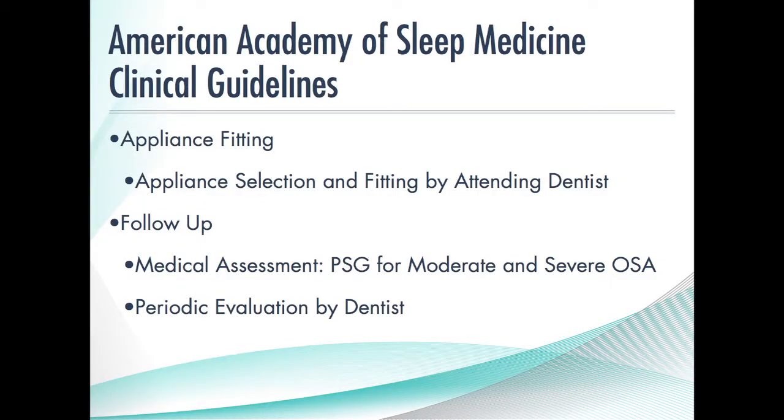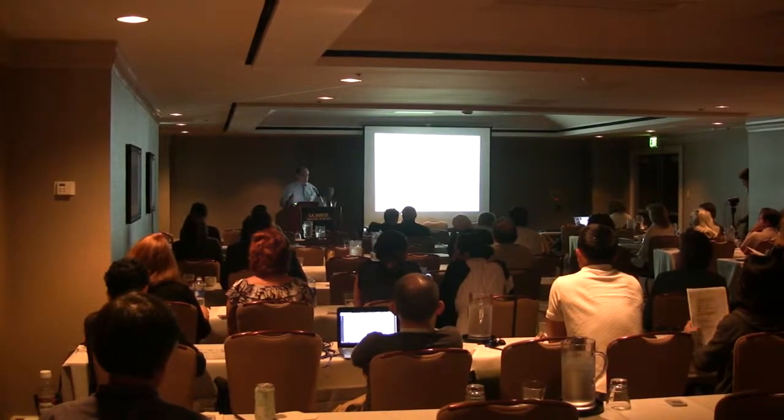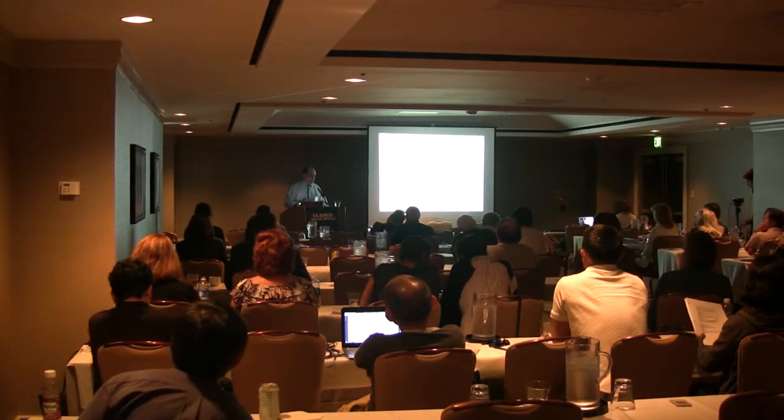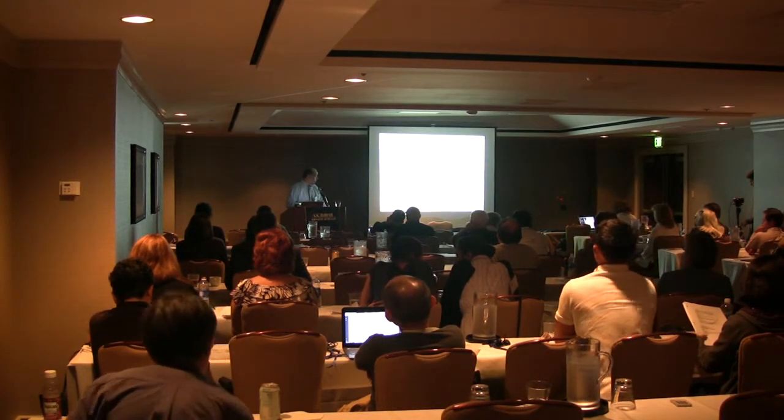So we fit the appliance, obviously we follow it up, and then we periodically evaluate the patient. Depends upon the medical group, how often we get to see them. And then when we're done, we need to do a follow-up sleep study. That's critical. Is it working? And people will come back, they'll report, yeah, I feel better, I sleep better, my wife doesn't complain, I don't have bruises and bumps in my ribs because I'm getting elbowed by my wife now.